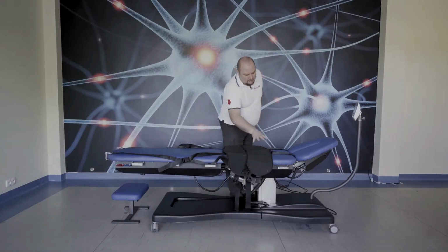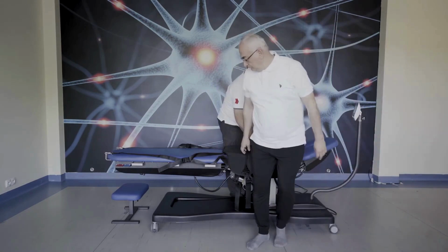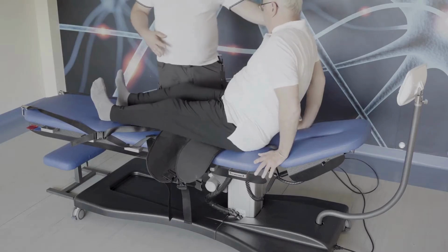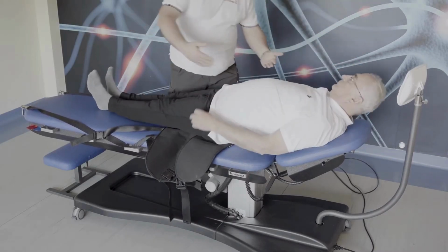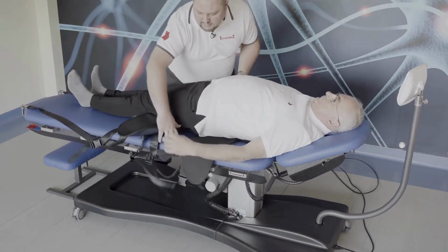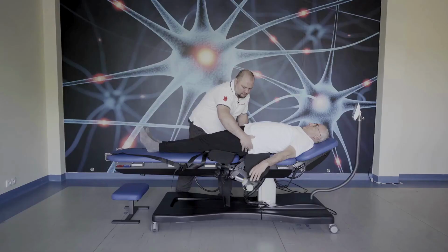We should ask the patient to sit on the neutral, stable middle part, lie down on his back, and move a little lower. The pelvis should be below the gap.